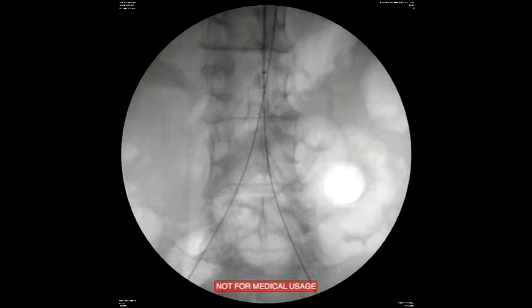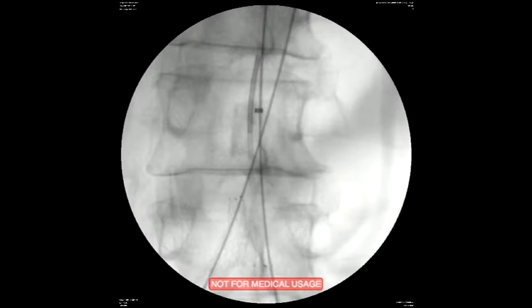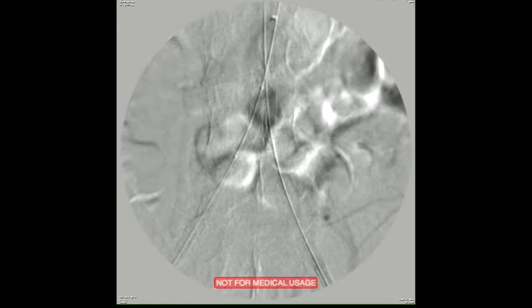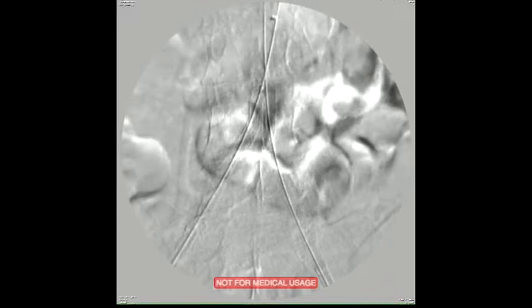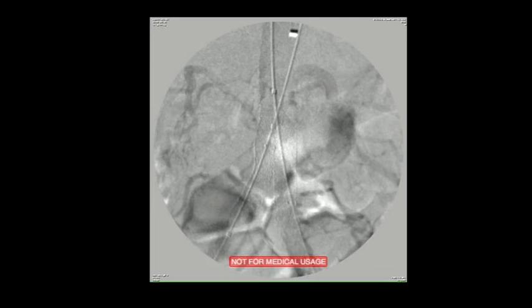Balloon, and then it's as usual. You can see bilateral wires, kissing balloon angioplasty, as post angioplasty, and then we place stents. And I'll not waste your time with this. By now it's pretty standard. All of you. Yeah, okay. And we finish with this.